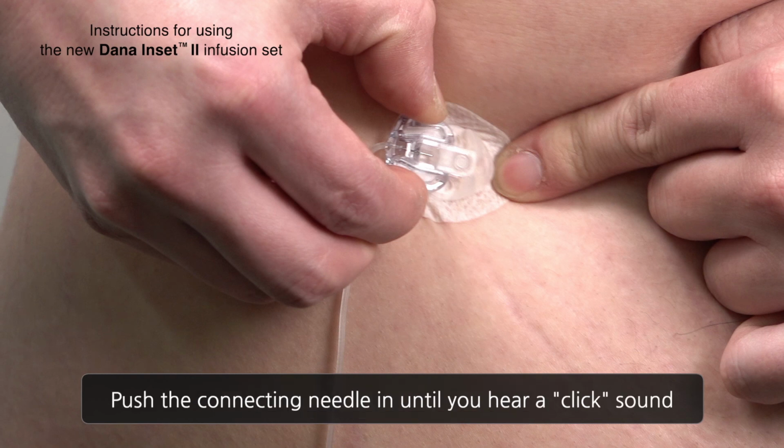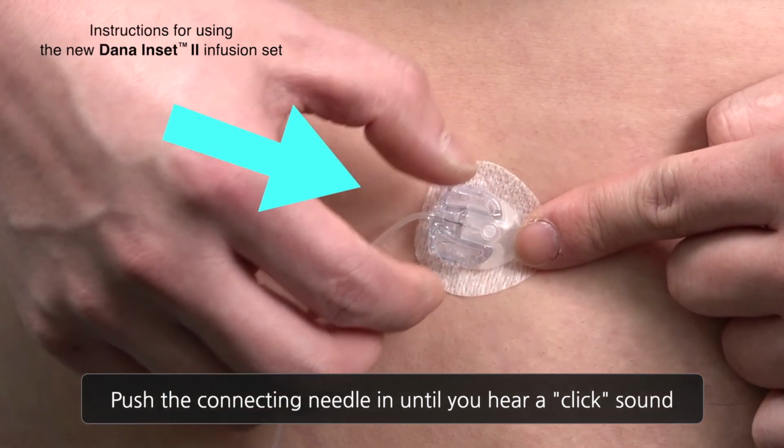Push the tubing connector inwards, until a click sound. This confirms that the connection is secure.